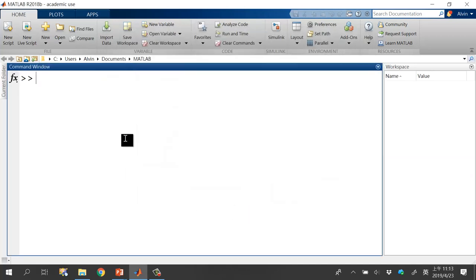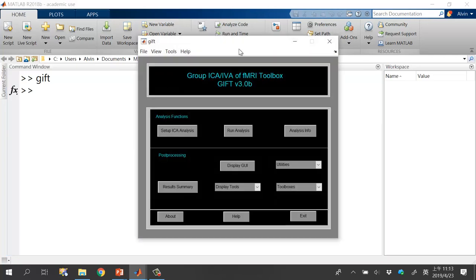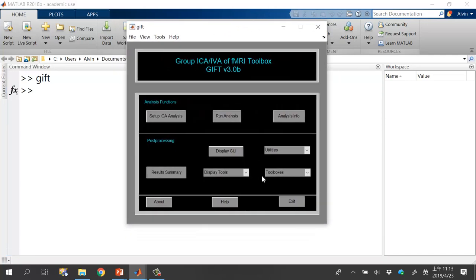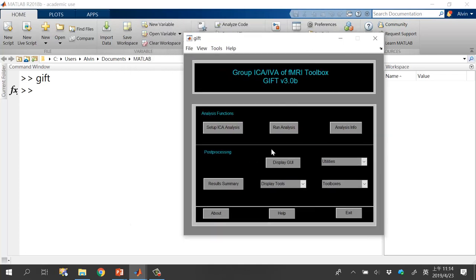To confirm you set it up correctly, type 'gift' in lowercase only — do not use uppercase. If set up correctly, the GIFT interface will pop up.